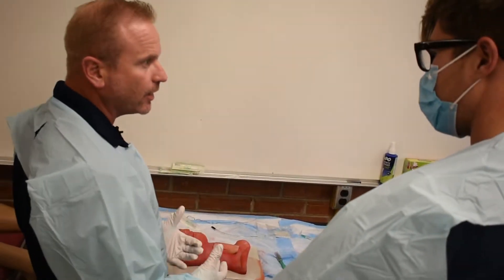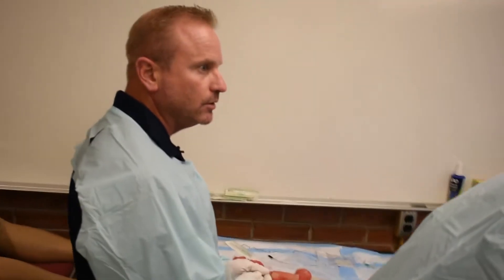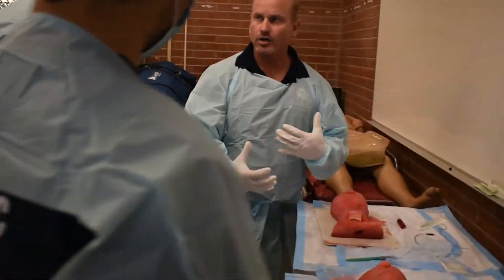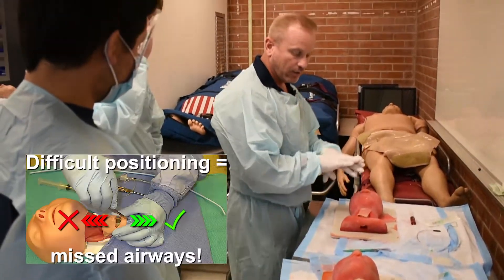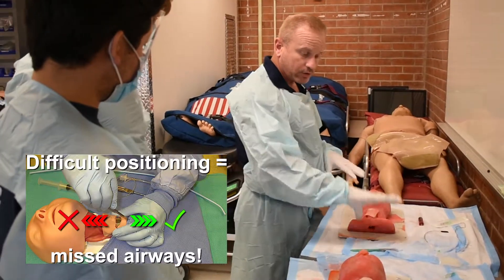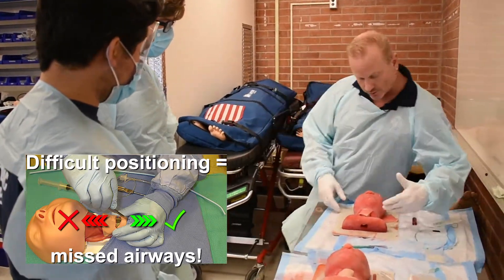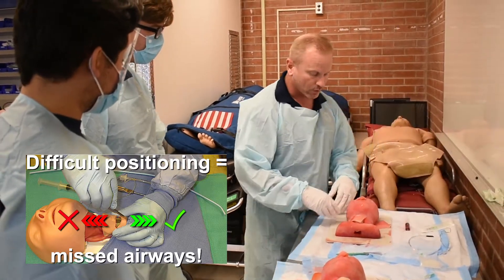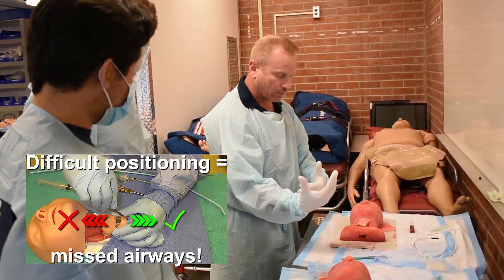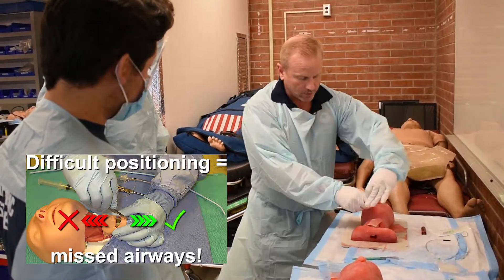What's our end point? What are we trying to do? Get oxygen to the lungs. When I say be on the right-hand side, if you're a right-handed clinician, those lungs need to be on your right-hand side. You're always going to be on the right-hand side as a right-handed clinician because you're going to hold and you're going to cut. You can't do the opposite.